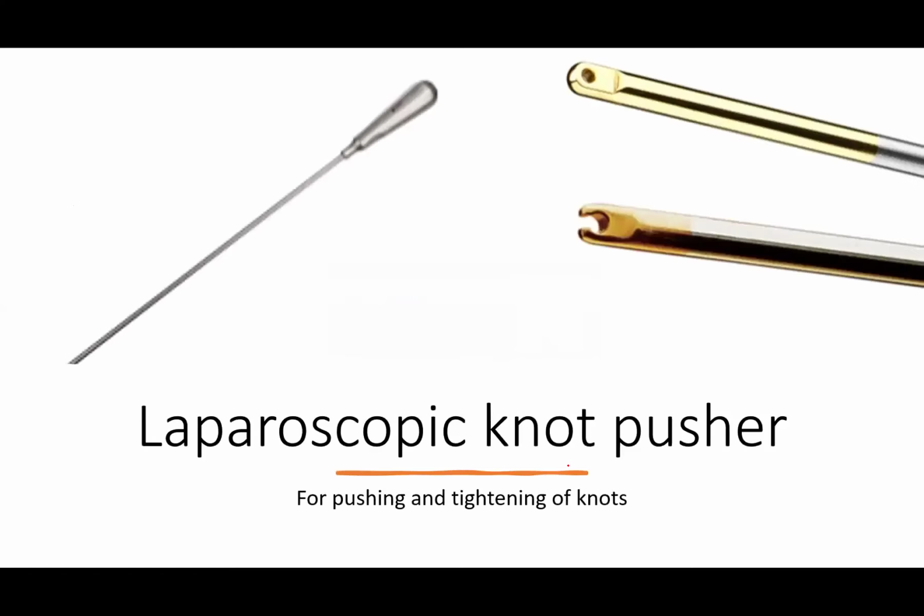Now, the laparoscopic knot pusher is for pushing and tightening of knots. When you make an extracorporeal knot outside the peritoneal cavity, it's called extracorporeal knotting. You use the knot pusher. You use this tip to push the knot to the structure you want to ligate.